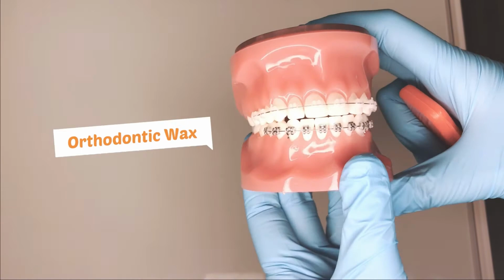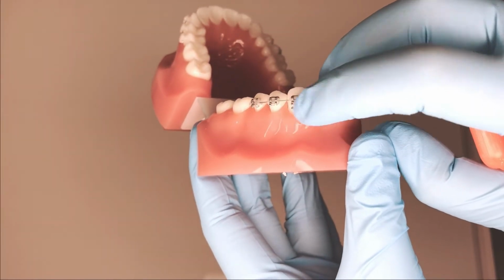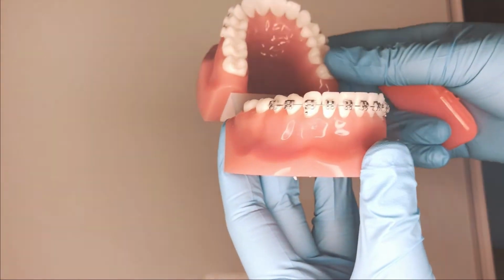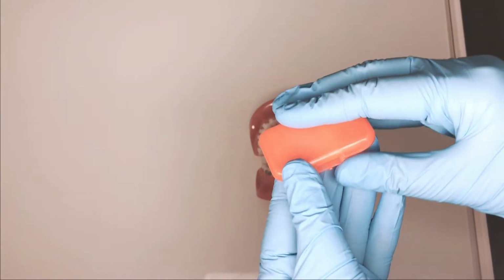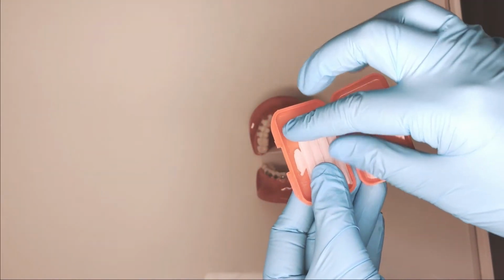Let's talk about wax. You may be noticing that some of your braces are rubbing on the inside of your cheeks and lips. Before you're used to it, you should use orthodontic wax to cover the brackets.